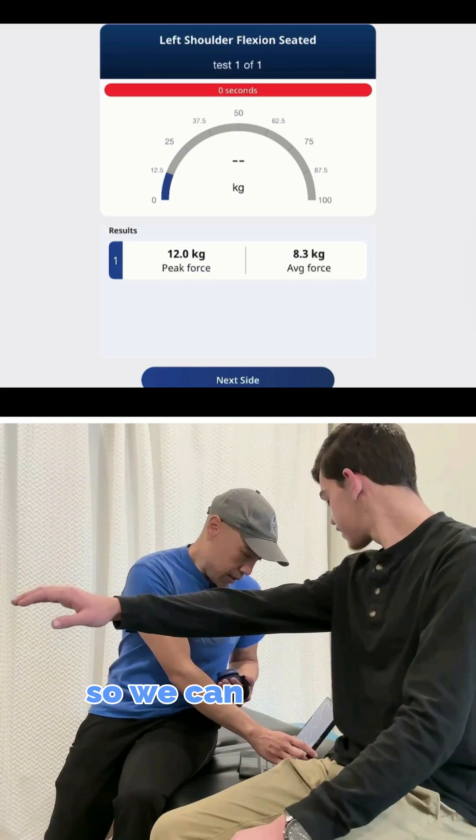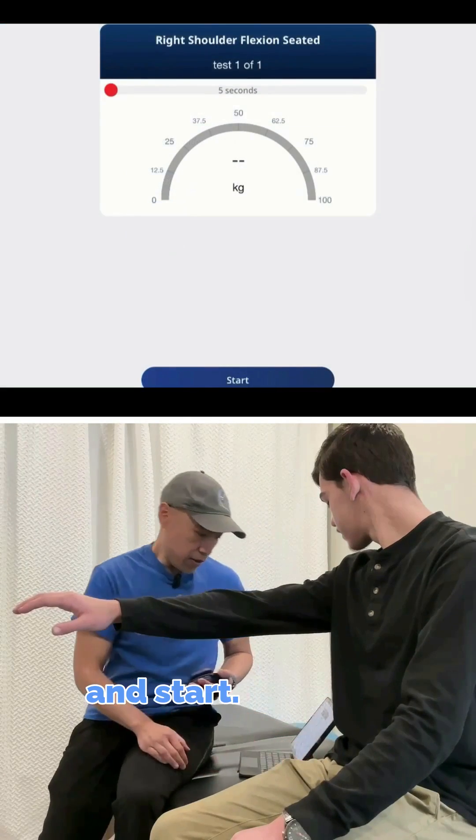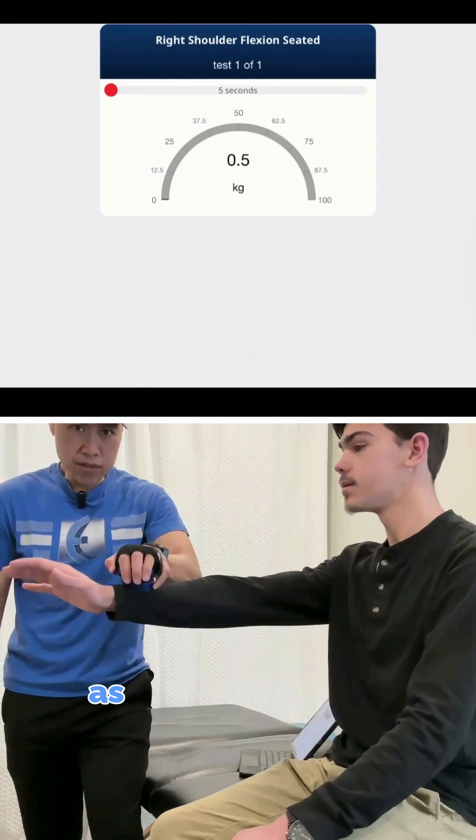Let's just check the right side — so we can easily switch to the right side and start. So again, it calibrates itself, and go ahead and push up as hard as you can.